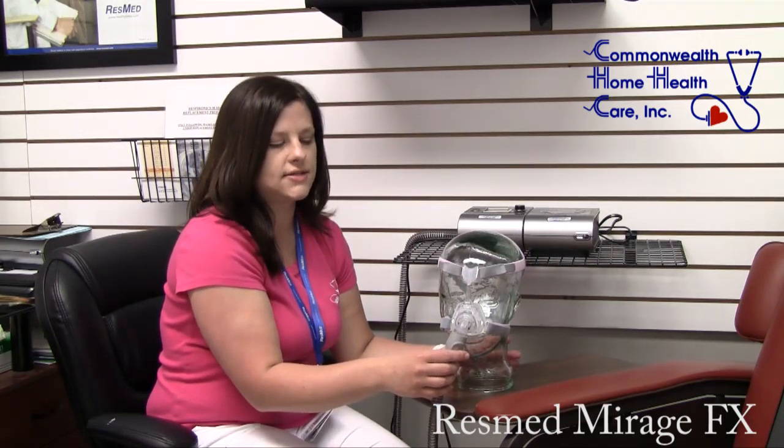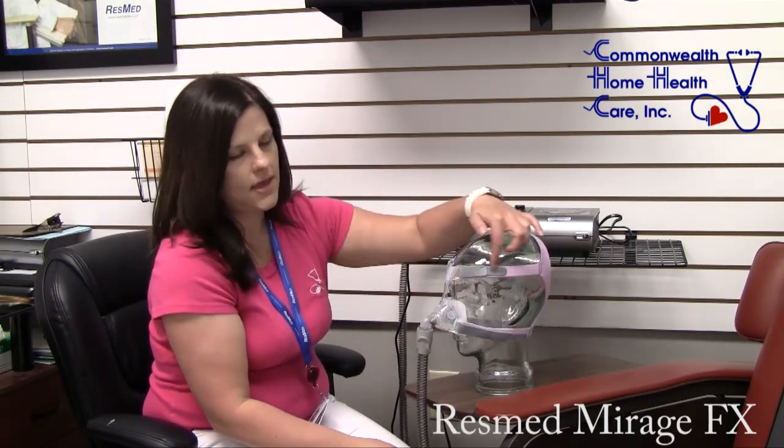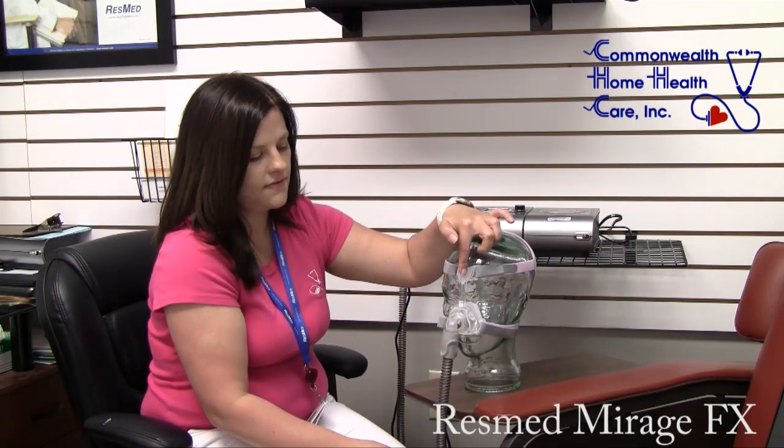This is the new mask from ResMed, the Mirage FX. This is the model for her. It comes in a standard size as well as an extra wide. It's real lightweight and durable. The headgear on it is lightweight. It does not have the cushion at the forehead piece, so it's very flexible.